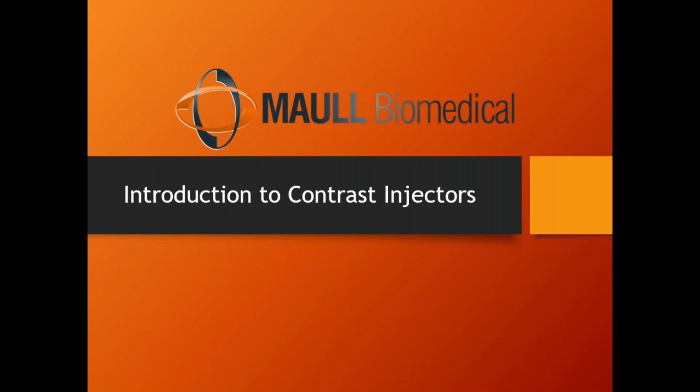All right. Before we get rolling on this one, just real quick, so everybody's on the same page. When it comes to imaging, we're going to take an X-ray of a patient. We have the patient on the table, and the X-ray tube is above the patient, and then the image receiving device, which used to be film but now is CR or DR plates, some electronic plate that digitally captures the image, is underneath or inside the table. So the patient's on the table, X-rays come out of the X-ray tube and they go into the patient.